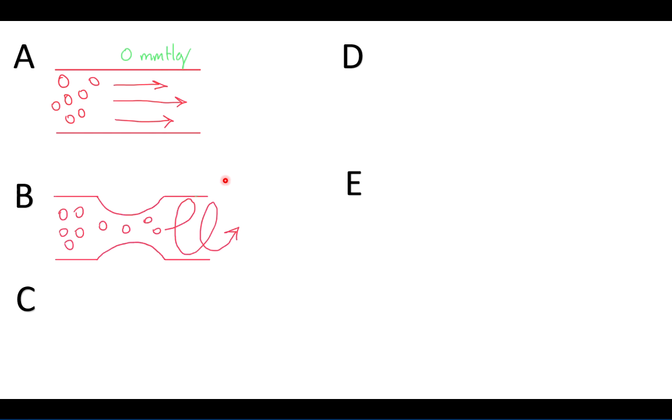So if we were to place this head of the stethoscope here, there's no sound that is being made by the red blood cells. But as you're aware, as you start to slowly inflate the cuff, we'll start to hear a slight tapping or knocking sound. Now, before you place the cuff on, we're at 0 millimeters of mercury.